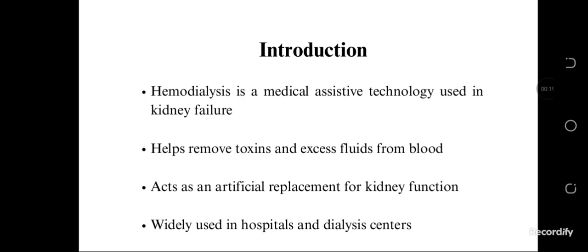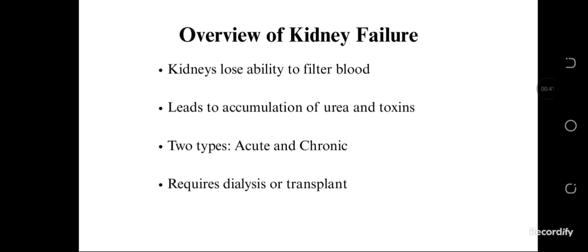Hemodialysis is a medical assistive technology which is used for kidney failure patients. It removes the toxins and excess fluids from our blood. So it acts as an artificial replacement for our kidney function, and it is also widely used in many multi-specialty hospitals and dialysis centers.